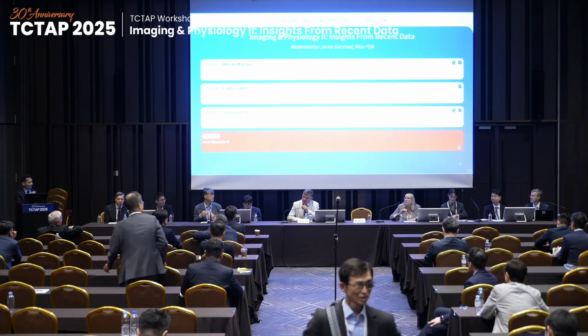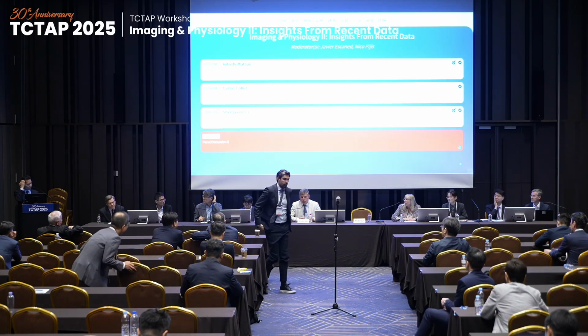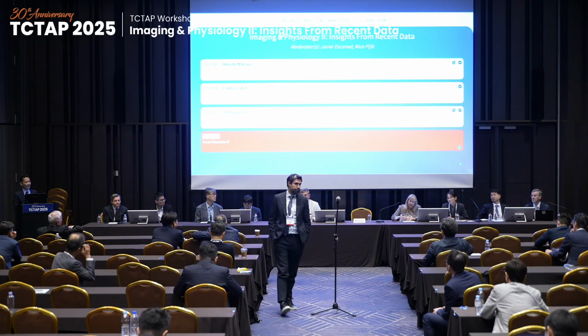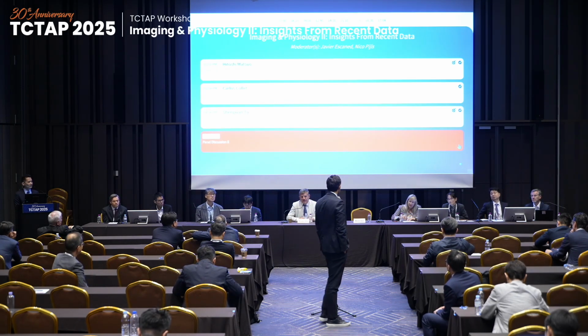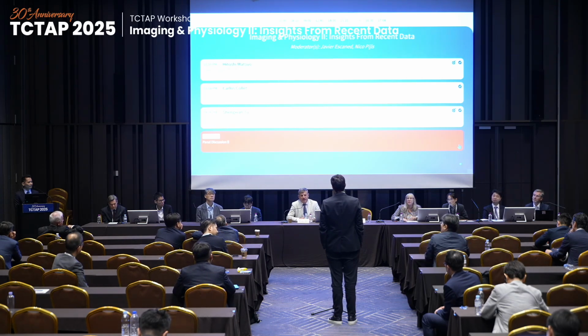Carlos, when you perform such a PPG procedure, you do it in combination with FFR. How do you do it in clinical practice? It is just a manual pullback maneuver. Does it take much time, or is it done very rapidly?